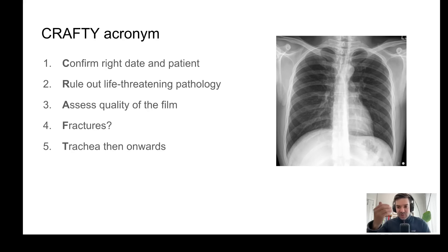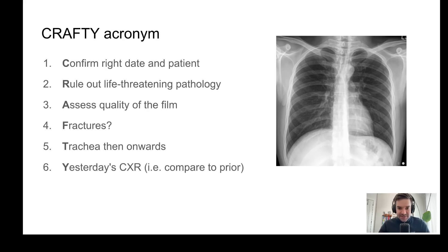Are there any obvious fractures? Then the approach I take is going from the trachea and working outwards — other people work outwards and go in, you do you, but make sure to be consistent. And then most importantly, find yesterday's chest x-ray — find an old chest x-ray and compare what you're seeing today to a past x-ray that's available.